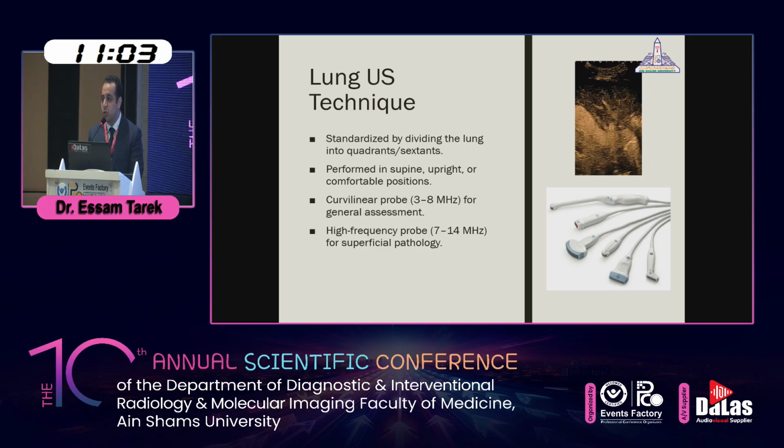The probe that I'm using, most of the time, is the curvilinear probe for more anatomical detection. For more specific details, we can go for the linear transducer, which is more superficial, giving us more information.